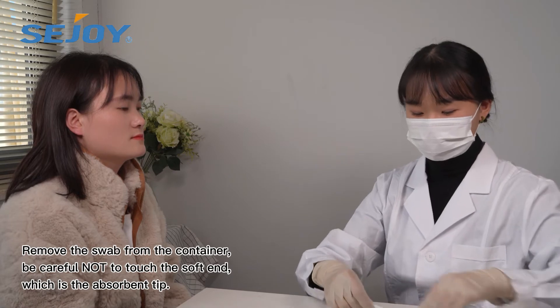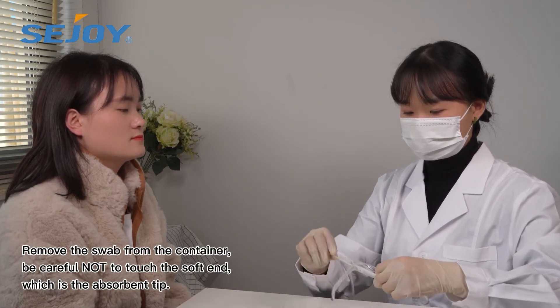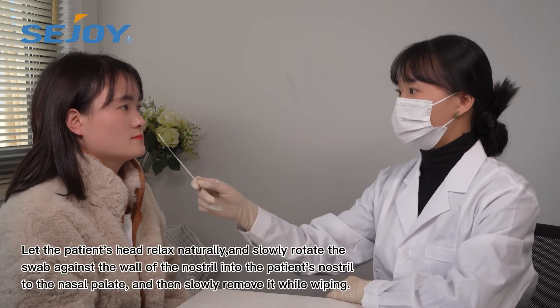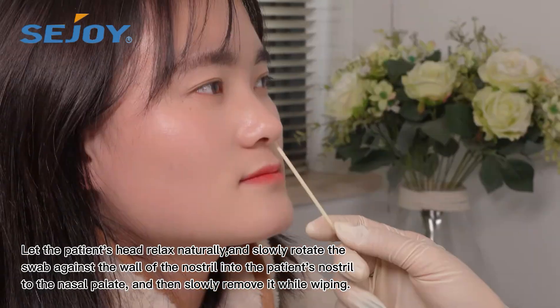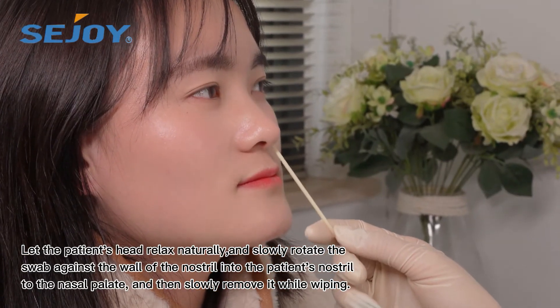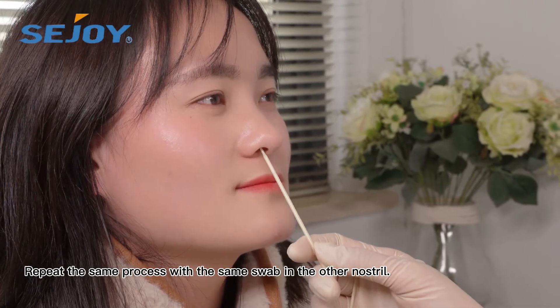Remove the swab from the container. Be careful not to touch the soft end, which is the absorption tip. Gently insert the swab into one nostril for 2-4 cm until you feel a bit of resistance. Repeat the same process with the same swab in the other nostril.